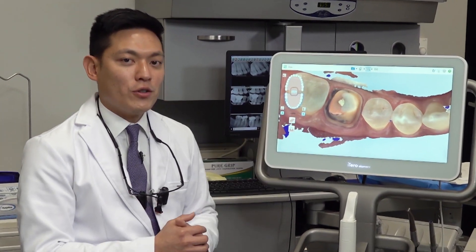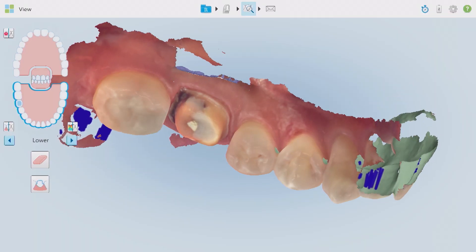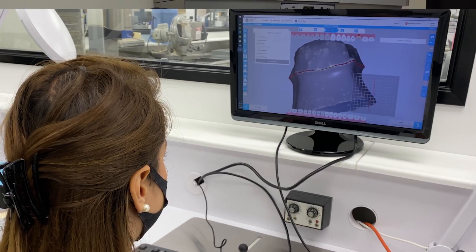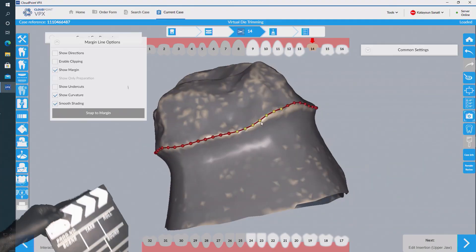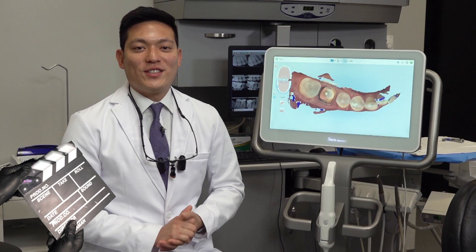If you cannot see the margins at this point on your digital impression, how can you expect someone else down the line — the dental technician — to know where to position the margins?